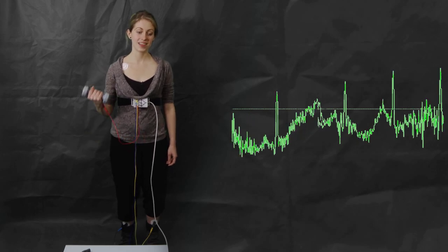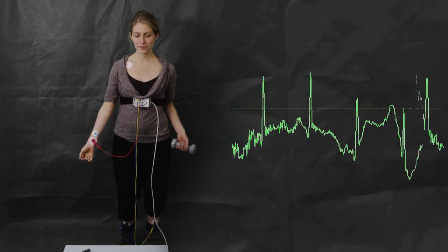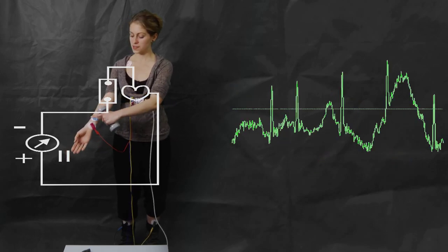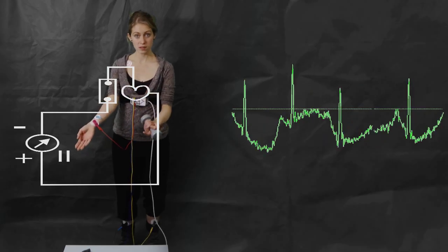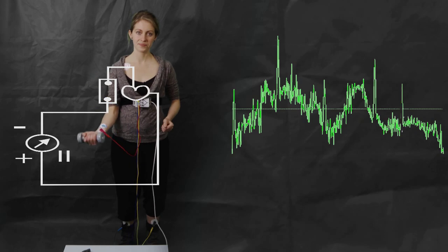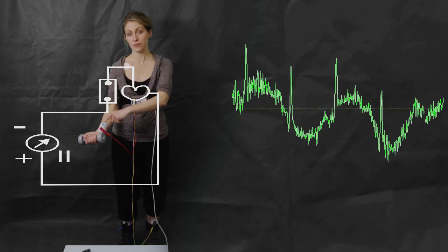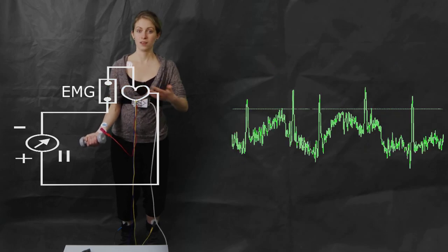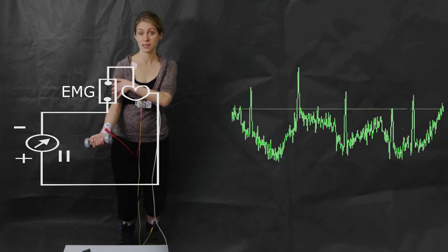So very quickly we can see that the ECG is heavily polluted with artifacts. And why would that be the case? Well, at rest, my arm functions as an extension of this cable, and this is convenient for electrode placements. So we simply place the electrode here. But then, when I'm doing this activity, this light exercise, the ECG gets polluted because on its way down to the wrist, it picks up EMG noise from the activity of my biceps. So we have to find a way of getting around this and try to avoid all the noise coming from this area.